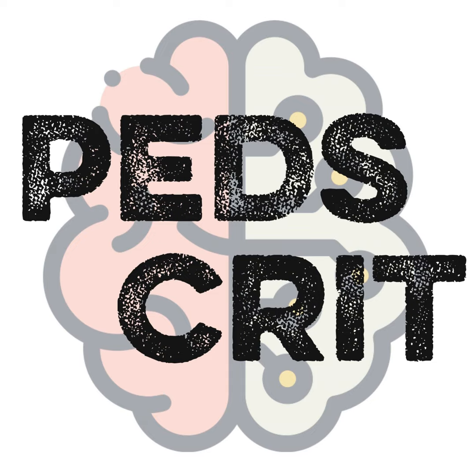I once got a chest x-ray read after we cannulated a patient for ECMO. The radiologist actually called me and said, I just wanted to talk to you because this is the worst ARDS I have ever seen. And I said, yes, thank you, I know that's the diagnosis I would give him too. And he said, and also there's a very large catheter sitting with its tip in the IVC. Is that intentional? I said, yes, you've identified the ECMO cannula and the reason that we can see this patient's lungs despite that. But what you don't see there is any air spaces. And you can expect to not see any air spaces for some period of time.